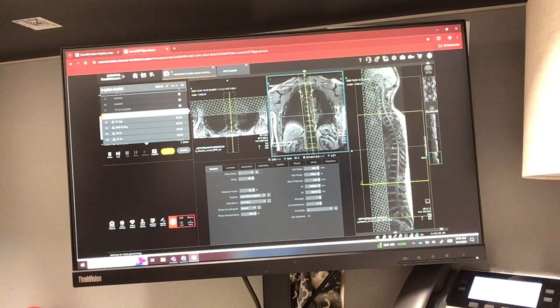Looks like I'm still covered. I have 15 slices. I'm still covering all of my vertebral bodies. Okay. If you thought that was a little close down here, you could add 17 slices. If your facility wanted those transverse processes, you may need to add a little bit more. But I like that, that looks good.